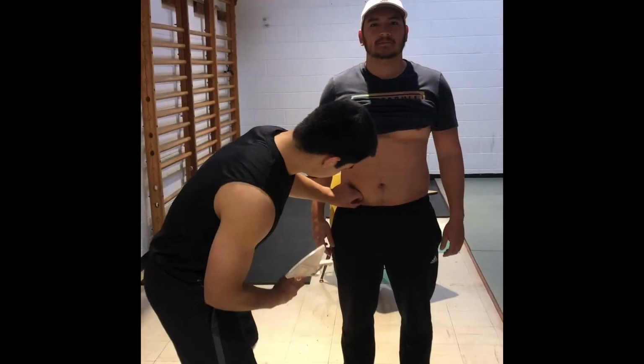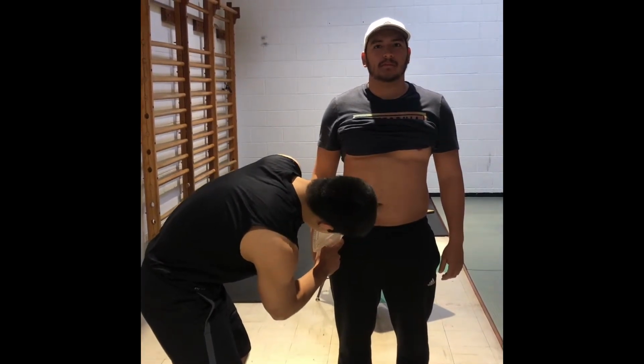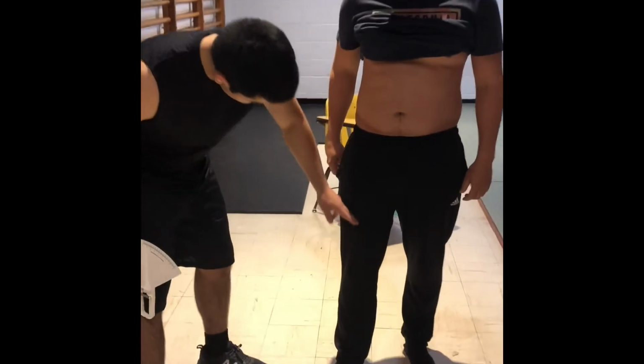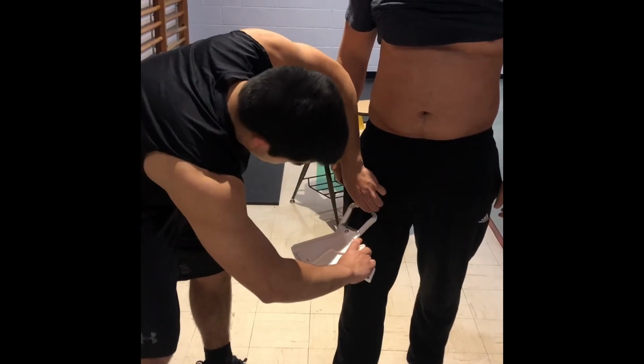Measuring for the suprailiac, it is directly in line with the natural angle of the iliac crest taken in the anterior axillary line immediately superior to the iliac crest. The thigh measurement is done midway between the proximal border of the patella and the inguinal crease.